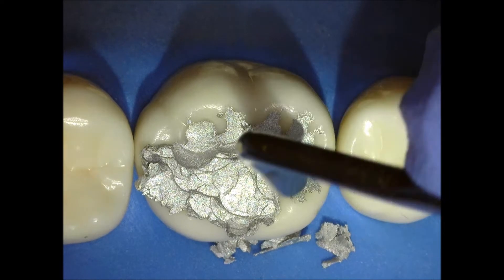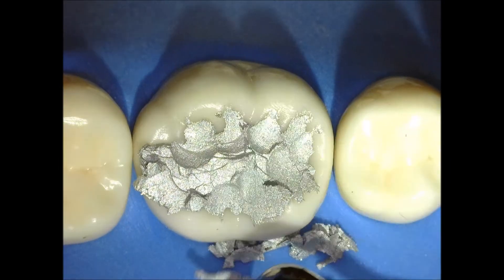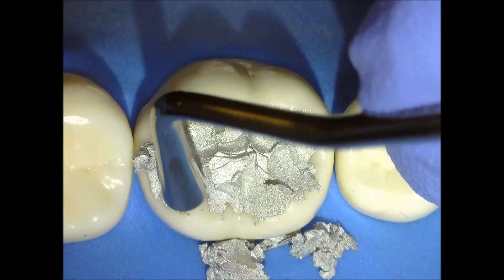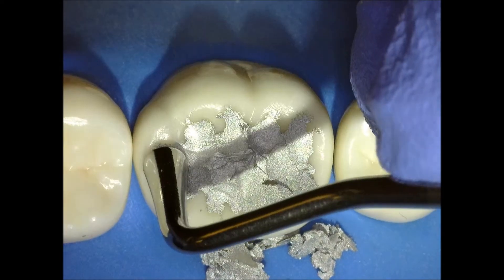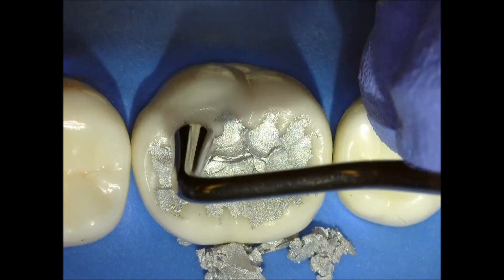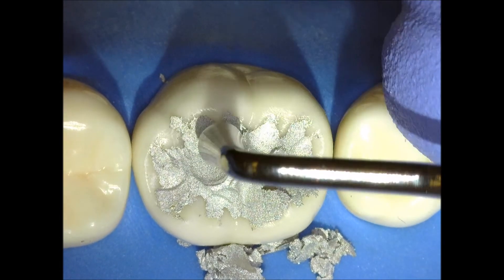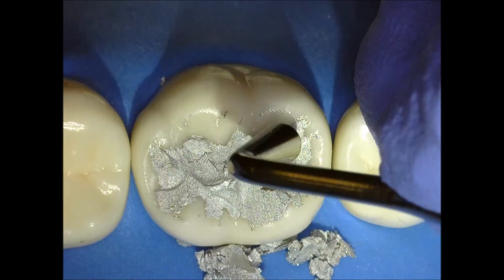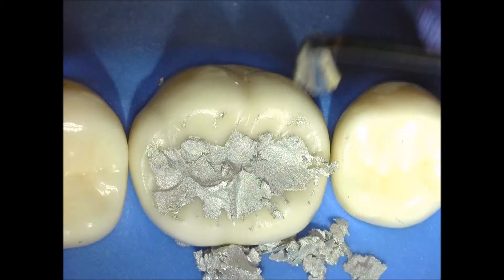This is going to give me my first anatomy. You go and slide the instrument against the cavosurface margin so you make sure that your cavosurface margin is flush with the cavity preparation. I go over again, changing the angle of the instrument according to the triangular ridges.